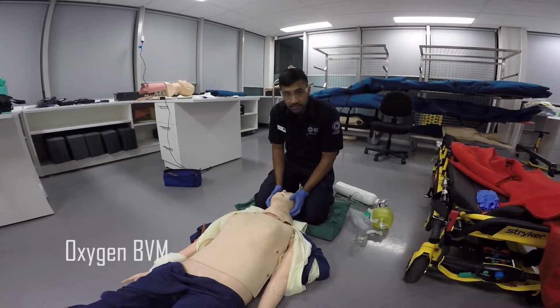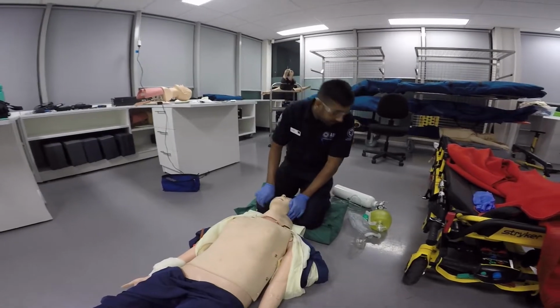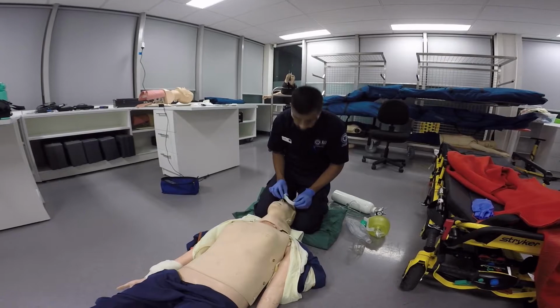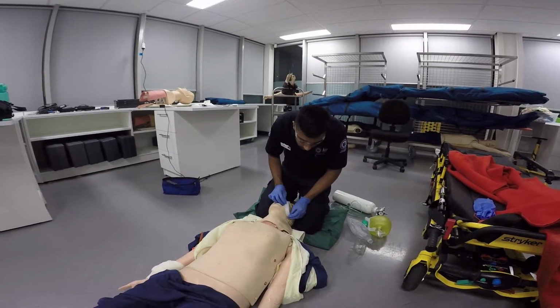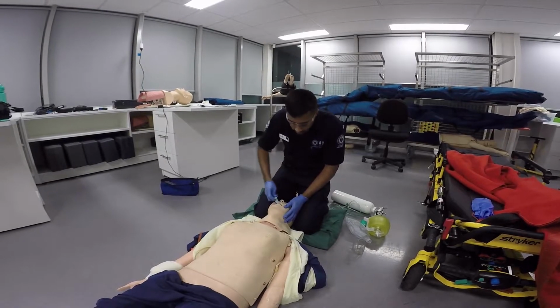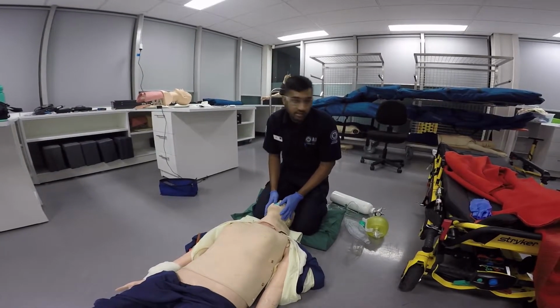Just to begin, I'm going to place the patient in a head tilt chin lift position like so. Then I'm going to place an OPA in the patient's mouth. To measure it, I'll use it from the corner of the patient's mouth to the mandible, placing it towards the roof of the patient's mouth, then doing a 180 degree turn so it sits there like so.